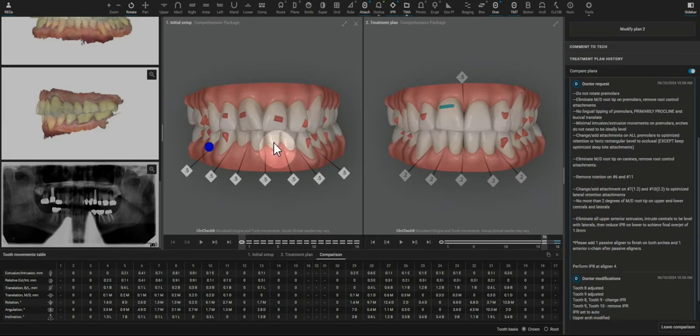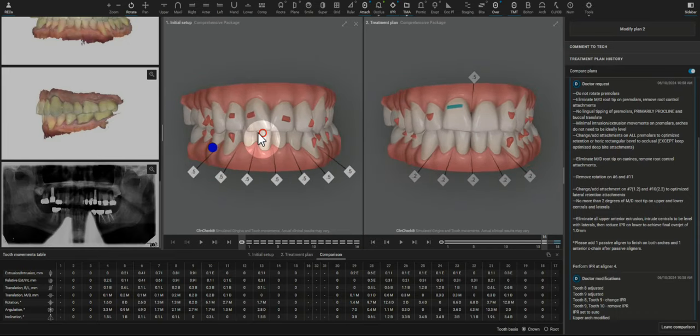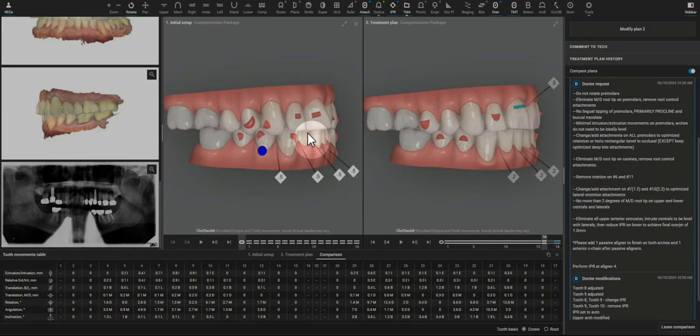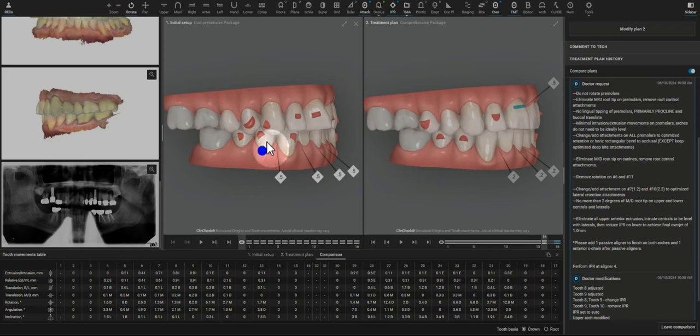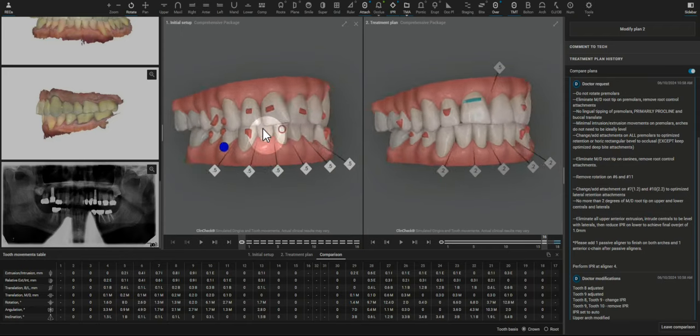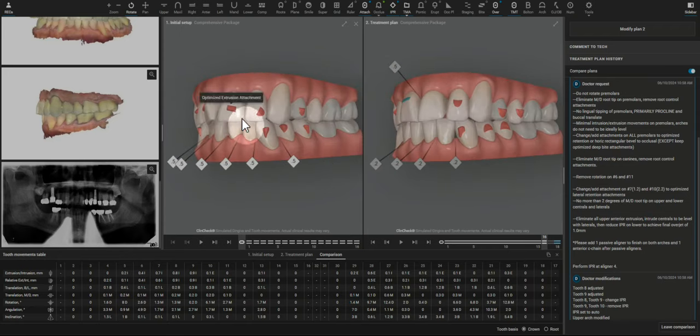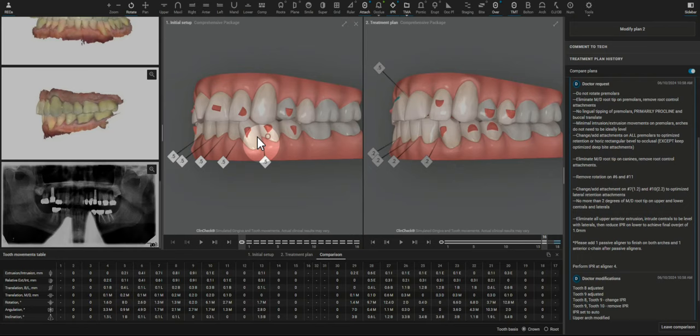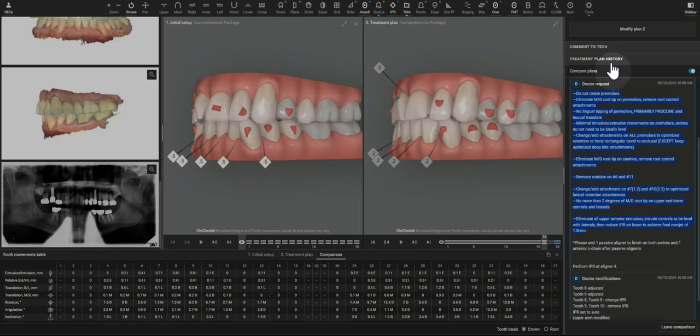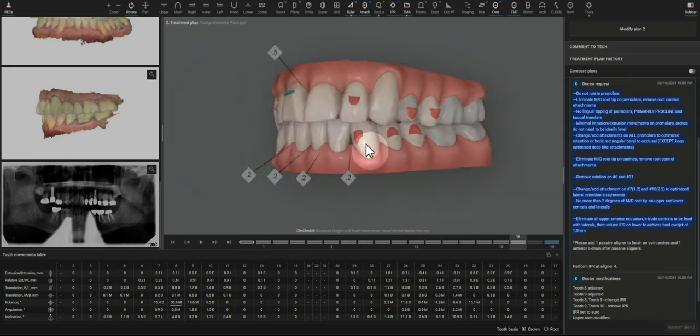Hi doctor, I have this ClinCheck just about ready to approve. From the initial ClinCheck, there are a number of unnecessary movements and I got those cleaned up by writing to the CAD designers, and now I'm looking at the final movements here.